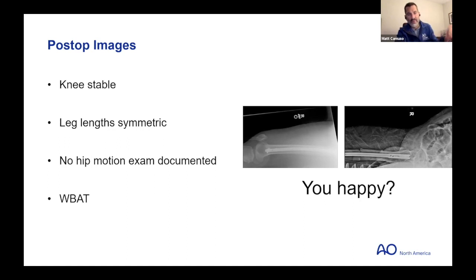And we'll learn later in the paper that we're going to show that they're good, but they're not great. And so we can be wrong, even if it looks right on the radiograph. So for me, I think it's really important to engage the patient and say, look, I know I got your length right because I know that the two ends are touching each other. I know the alignment's right because it's a diaphyseal fracture, but the hardest thing for us as surgeons to judge is the rotation and is it correct?